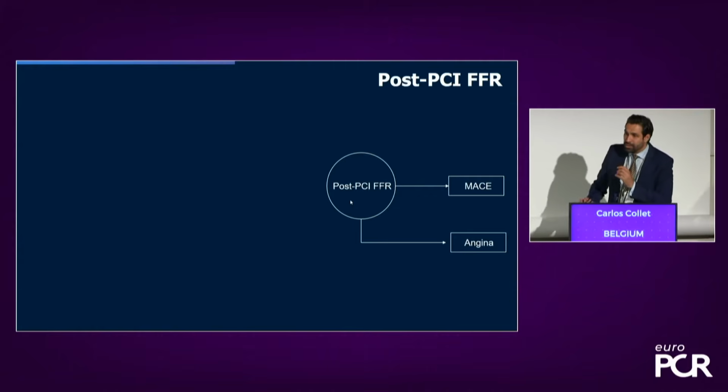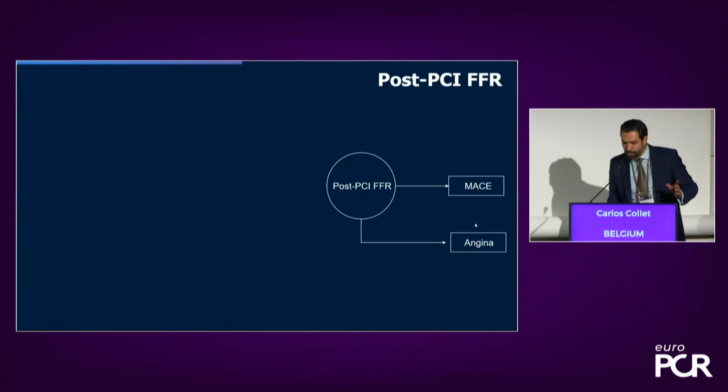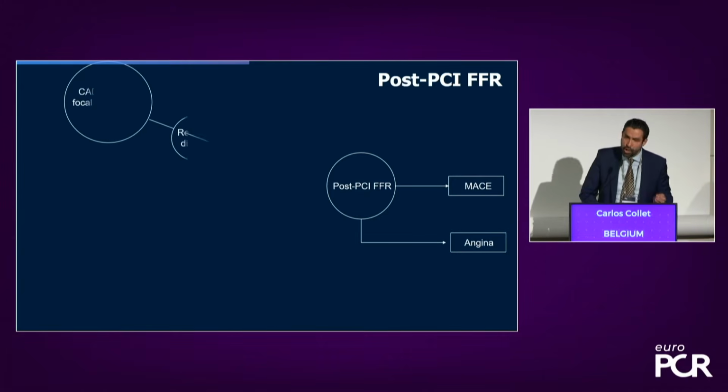So where we are today, this is what we understand. We understand that post-PCI FFR is related to MACE. We understand that post-PCI FFR is related with angina. But this is actually a bit more complicated.